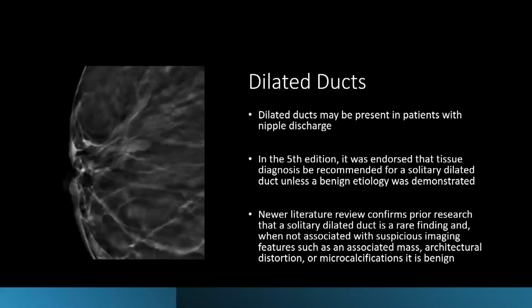So lots of conundrums. So here we go, post-aspiration with the residual papilloma that's grown again after original needle core biopsy, and then vacuum, where we tried to remove as much as we could. But obviously, we again recommended the surgical excision to the patient. And this time she finally did have it out.